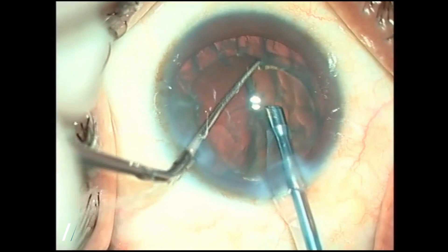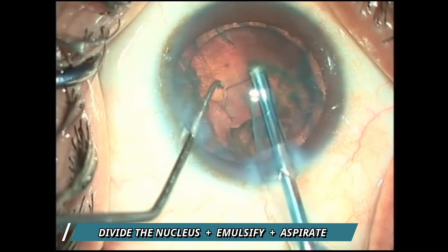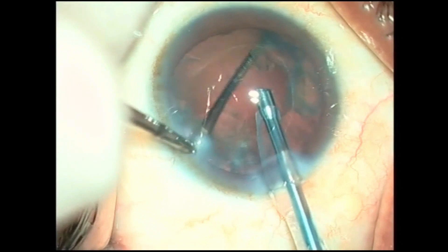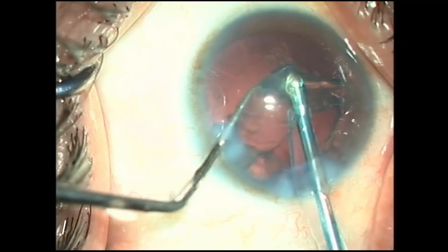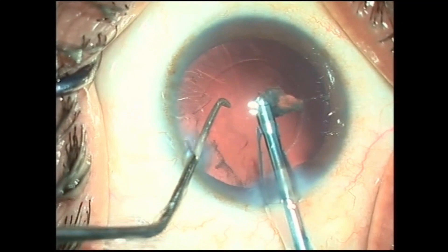Using the chopper, the other half is taken out, divided further, emulsified, and aspirated. We then remove the epinuclear plate with suction — just flip it and with suction and intermittent phaco bursts it is aspirated. The surgery is thus complete entirely within the central safe zone, without ever venturing into the peripheral unsafe zone.